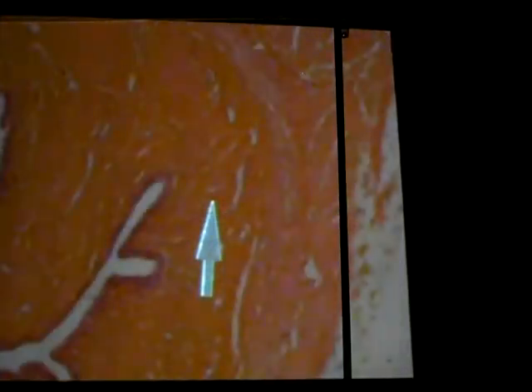And in the lumen, let me show you another slide. The lumen in the female urethra usually has this typical U shape. Alright, so this is a scanning view. So notice you have this kind of U-shaped lumen that you'll see, and that's usually characteristic of the urethra. So if you see that, well, not all our slides you're going to see that distinct U shape, but if you see that, you know that that's your urethra.